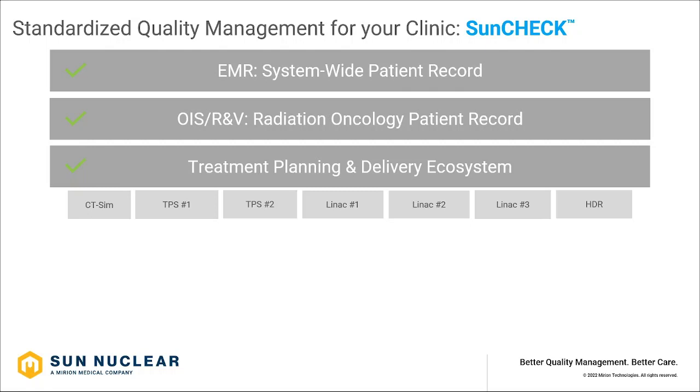Then most radiation oncology departments have a separate OIS, or oncology information system, or record and verify system, which they use to manage records of treatments which are very specific to the radiation oncology department. What SunCheck is able to do is offer a single quality management solution for radiotherapy QA. And this would include both machine and patient QA.